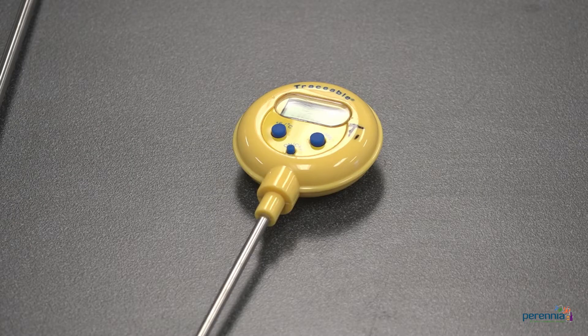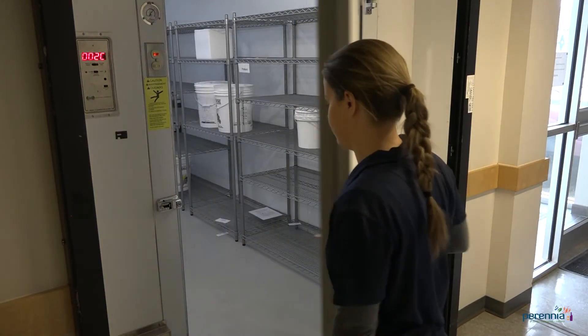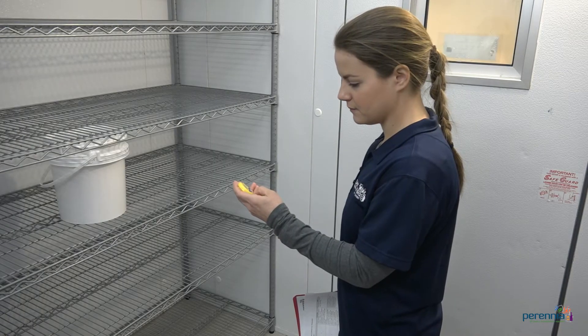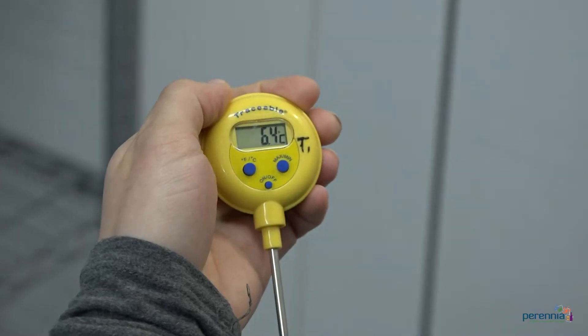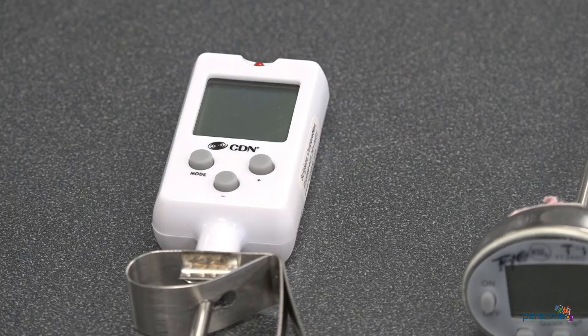Thermometers are important instruments used in food facilities. They are used to check the temperature of product to ensure it has reached the proper cook temperature that will render the product safe. Thermometers are also used to ensure that raw materials, ingredients, and product are held, stored, and transported at the appropriate temperature to maintain quality and safety. They are also used to ensure product is being cooled, thawed, and reheated safely.